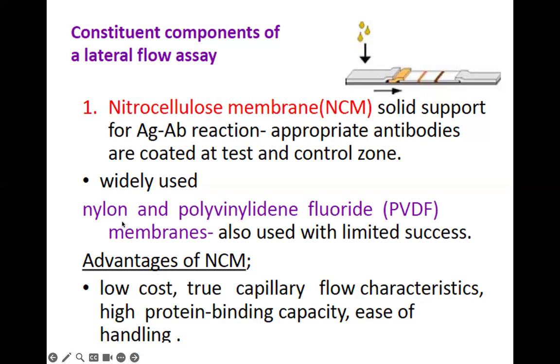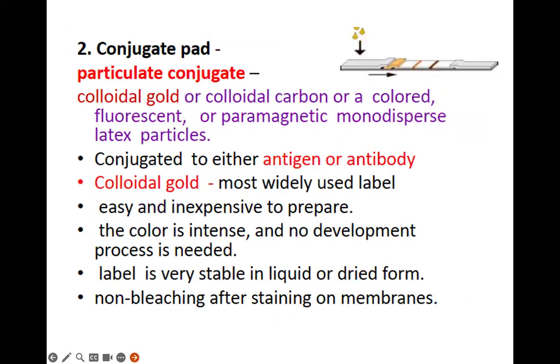So there's another one, nylon, which we are not familiar with. And if you ask, tomorrow we are more on nitrocellulose membrane. Yeah? So the advantages of nitrocellulose membrane, yes, it's low cost. Okay, it has good capillary action, but as I mentioned to you, you have to check in terms of porosity. It has high protein binding and ease of handling. Yeah, based on our experience, this is something that you can observe from the usage of nitrocellulose membrane.